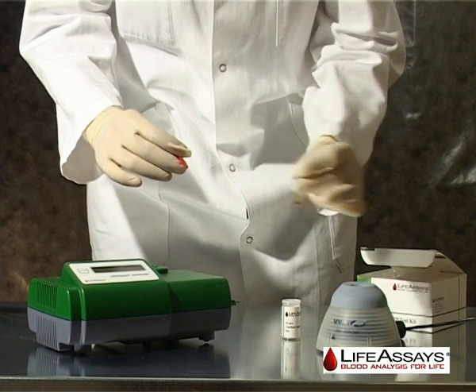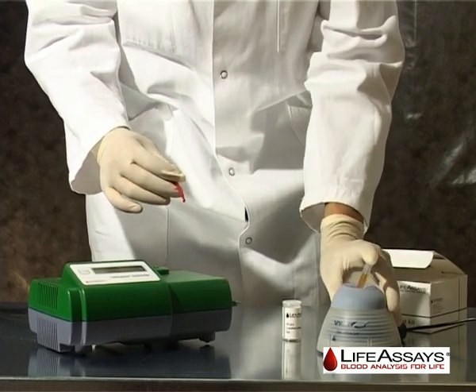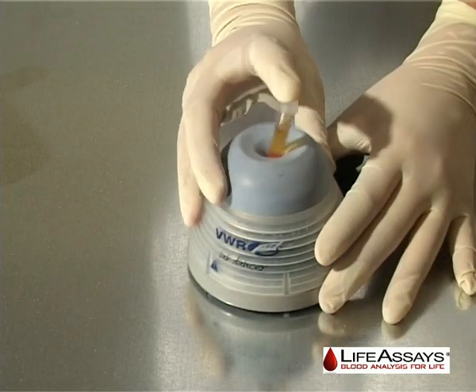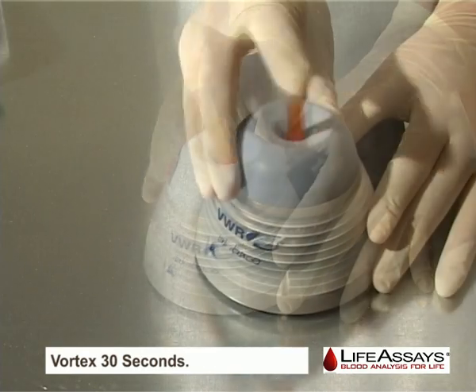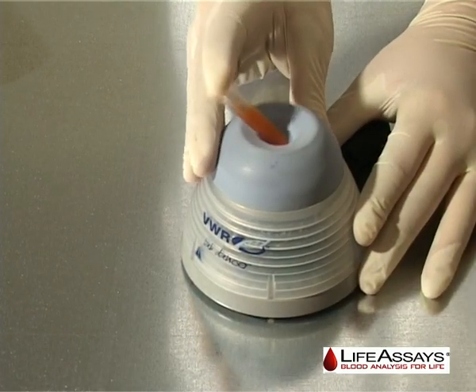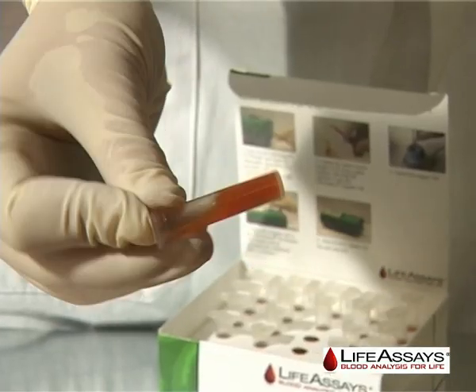Once unloading the reagent vial, the instrument will switch automatically to vortex countdown after 5 seconds. Vortex the reagent vial for 30 seconds. After the vortexing time has run out, the display shows 'insert vial 10'.